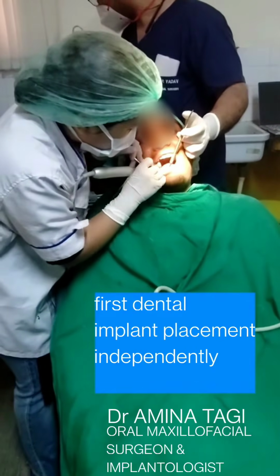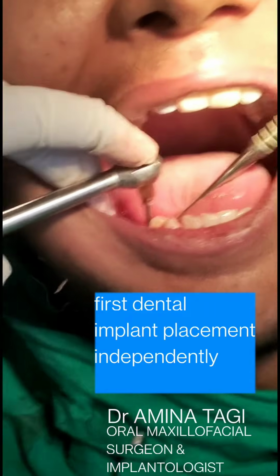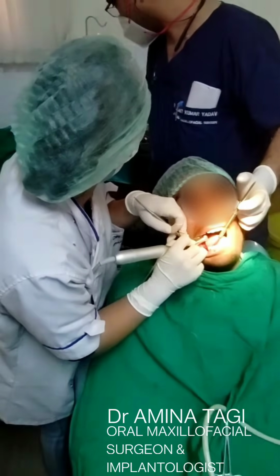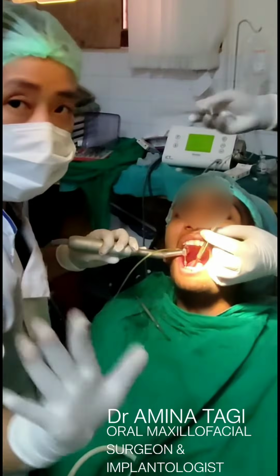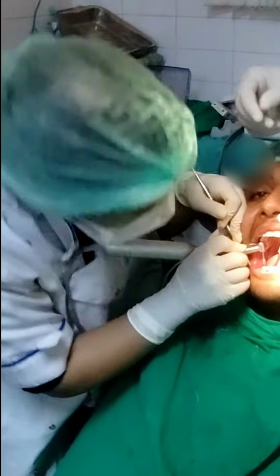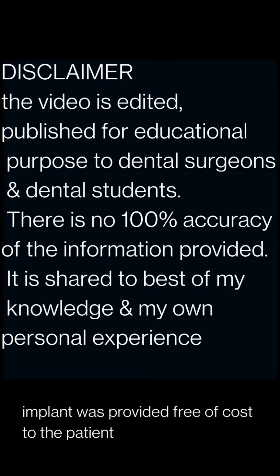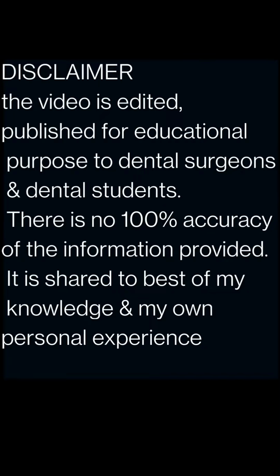So in today's video I'll be presenting you my first independent dental implant surgery case which I operated during my post graduation as a student. Special thanks to my professor for donating this implant free of cost. The patient was very young and the cost of the implant was not affordable for the patient as he was not from a very well-to-do family.